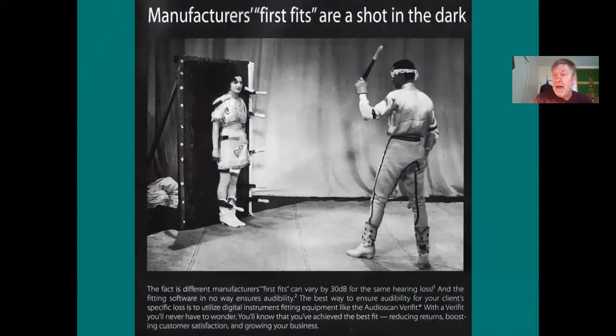And then you choose the manufacturer's software, Bernafon, Oticon, Unitron, Phonak, whichever, and you choose your hearing aid, and then you choose your fitting method, and then you take the audiogram from NOAH, put it all together, and push a button. So basically, take the audiogram, choose a fitting method, choose a hearing aid from a company, and hit set.